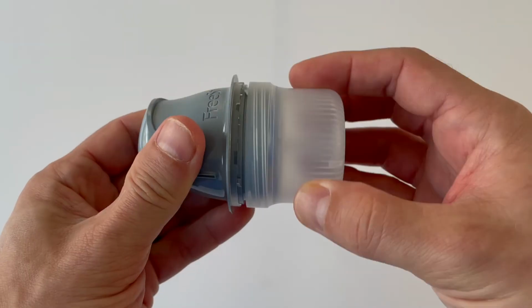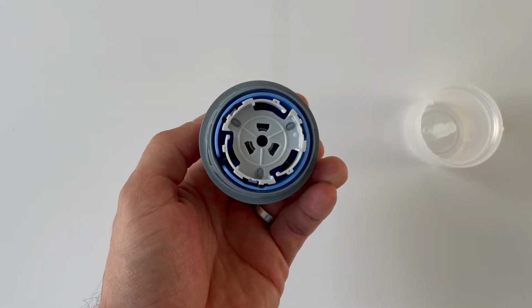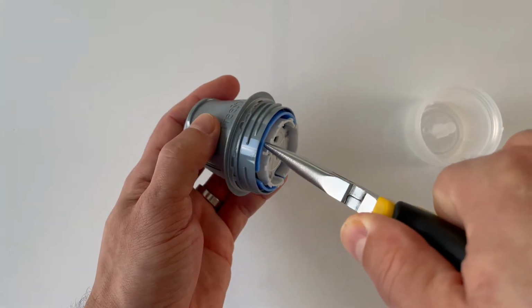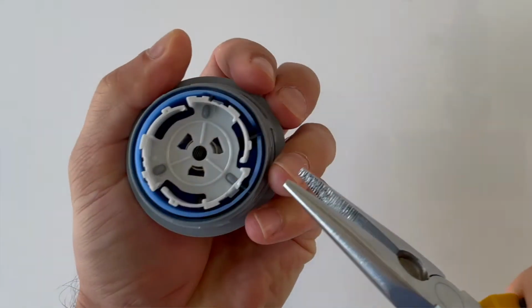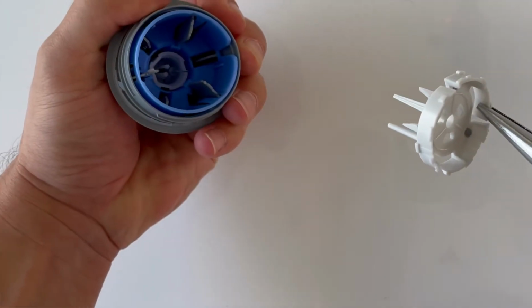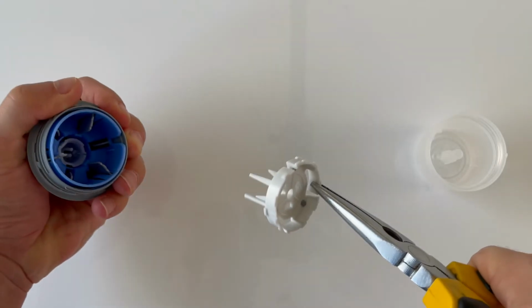And let's start with the bigger part of the transmitter. Unscrew the lid and pull out the white plastic part with your pliers. To do that, you need to make all of the 3 gray oval parts in the device loose, and when you break the final tab, the plastic piece will come out as well as a metal spring. The metal spring will jump out of the kit, and right under it is the needle.